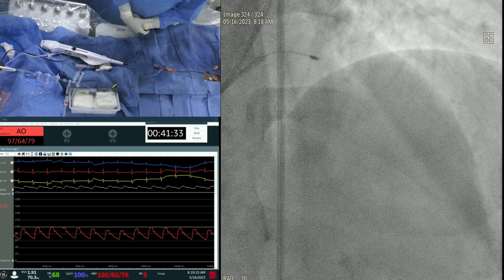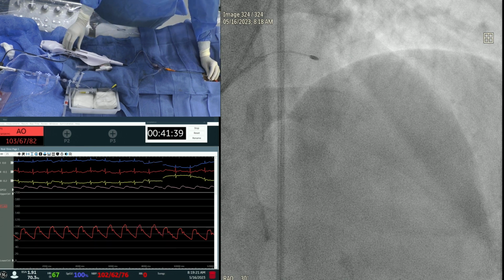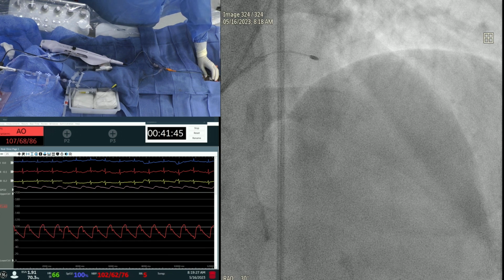Yes, because of that angulated view, you saw it in the angulated view. We'll do a few more, and if we cannot have it, then we were going to downgrade the burr to 1.25. Okay. So I see it. Nothing yet. No. Nothing yet. I need to see the rotation.